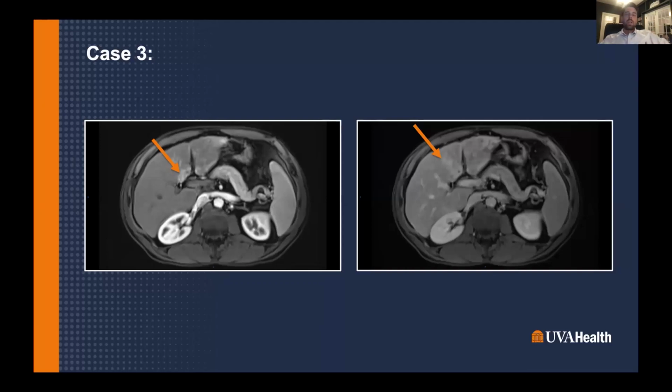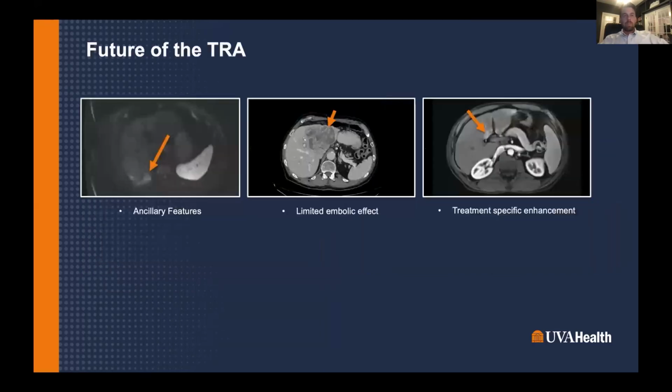These cases show the difficulties in interpreting, justifying, and conveying our level of certainty in determining lesion viability. My view is that the current treatment algorithm somewhat inadequately addresses these unique characteristics of radioembolization, whether that's how they handle secondary imaging findings like abnormal diffusion, quantifying change in enhancement of hypoenhancing lesions, as well as the persistent arterial enhancement and washout sometimes present in these successfully treated lesions.